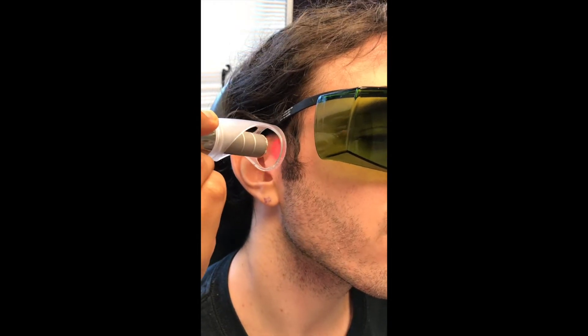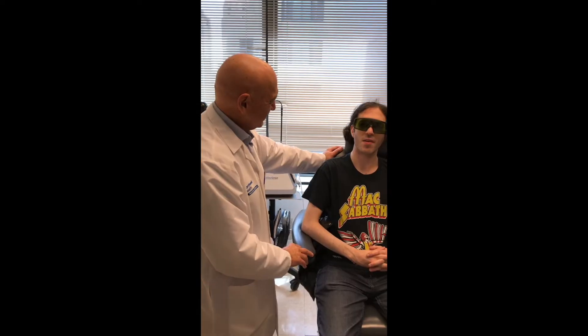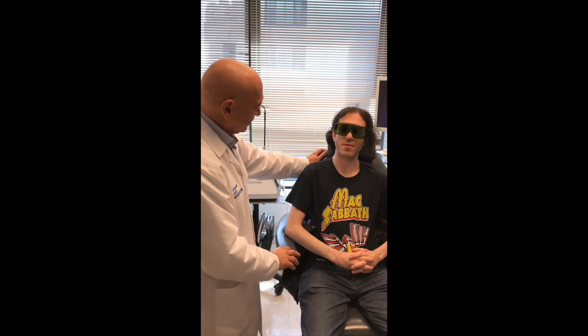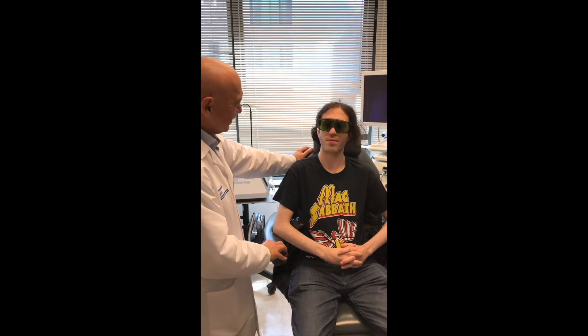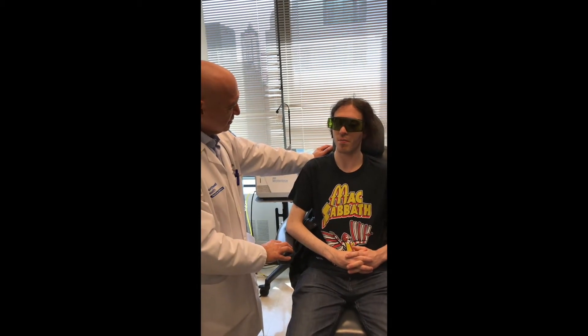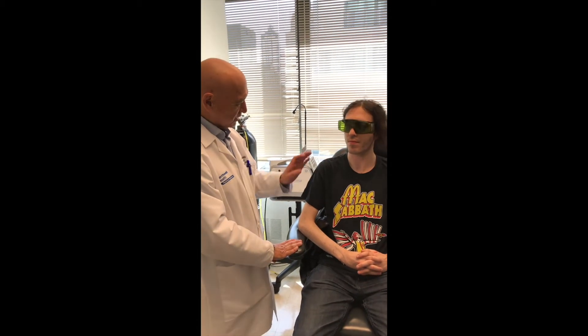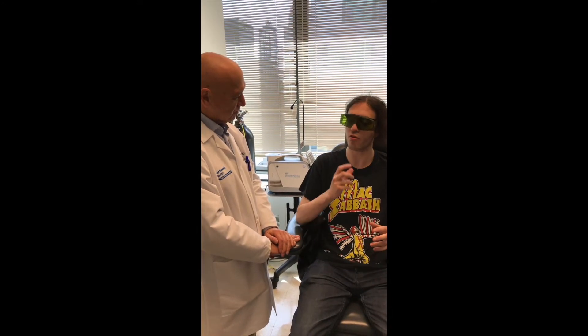We treated the jaw joint and the neck with the laser, giving some deep tissue therapy. How does it feel? The jaw is much improved — much, much better. You can open and close easily.